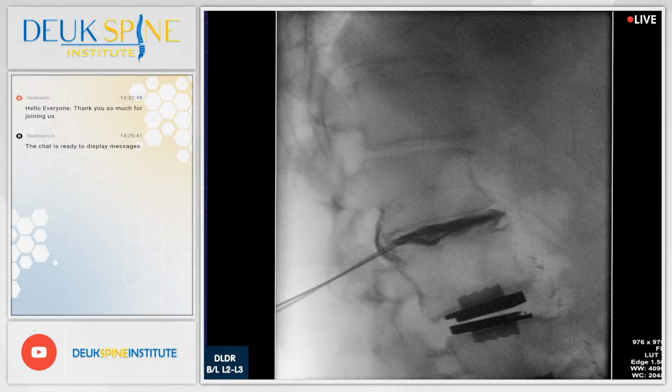All right. Dr. B, can I proceed? Shot? No problem.